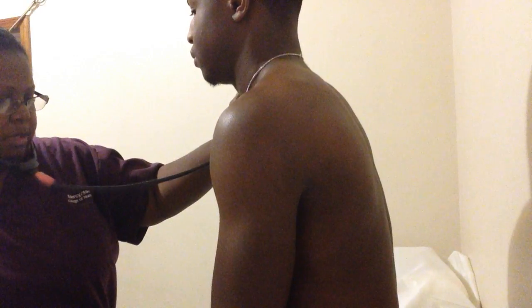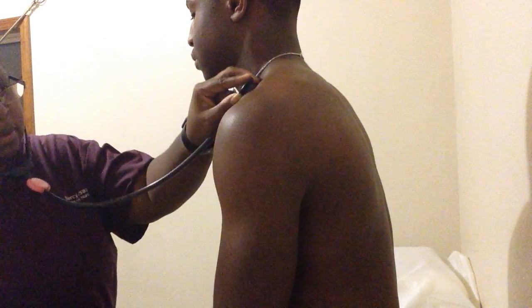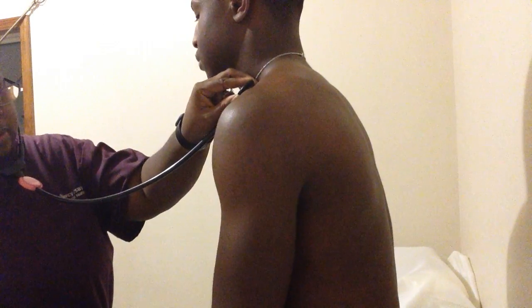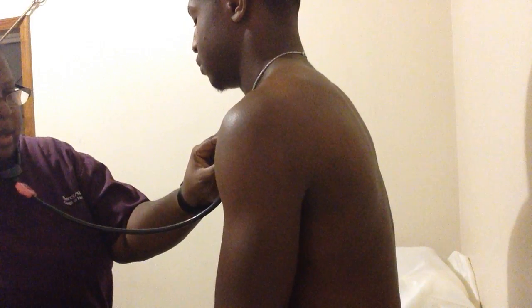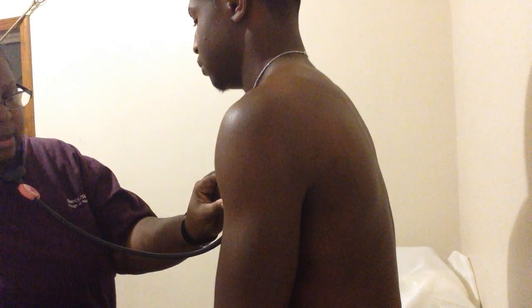Okay. The next thing I want to do, I am going to auscultate for lung sounds, starting above the clavicle. Every time the stethoscope touches your skin, take a deep breath. And doing it in a ladder motion.